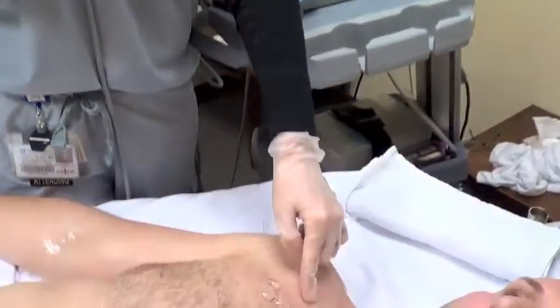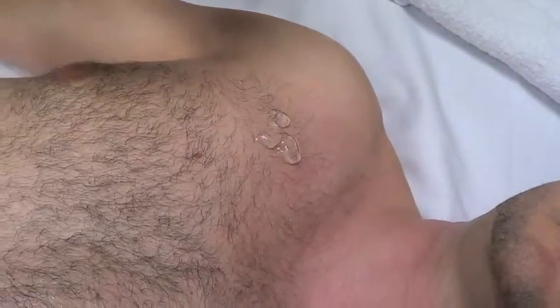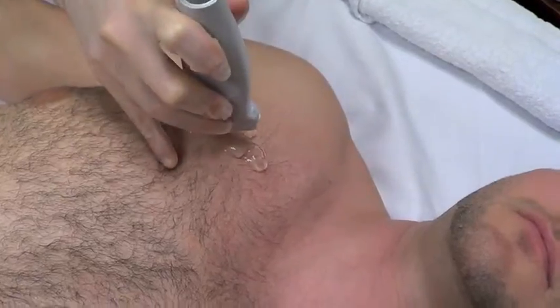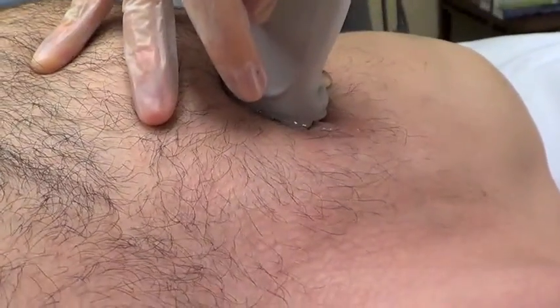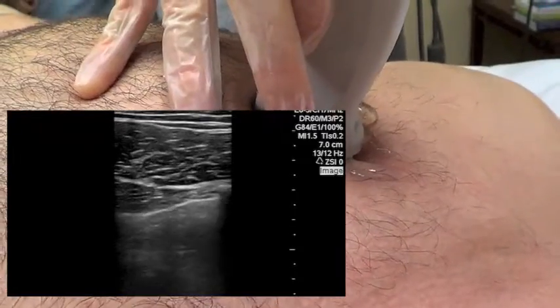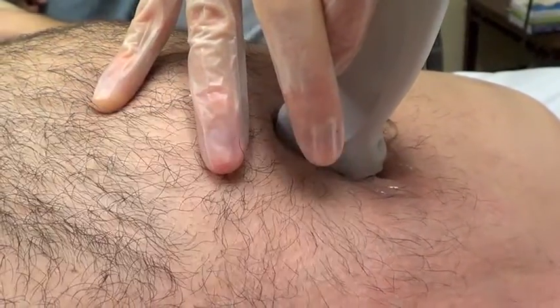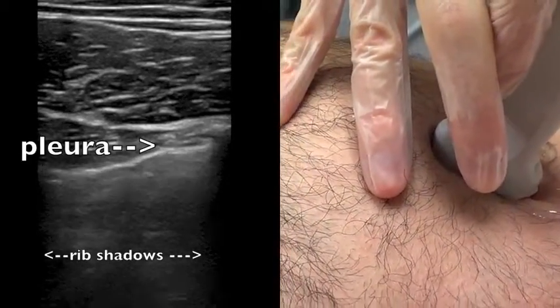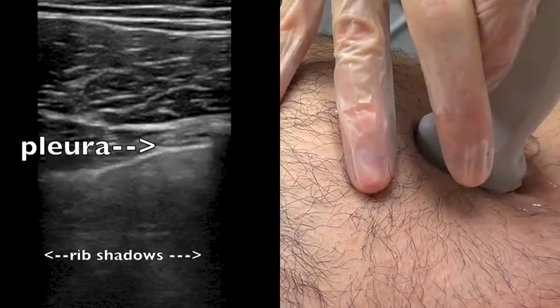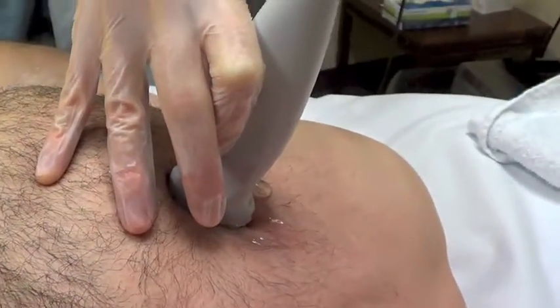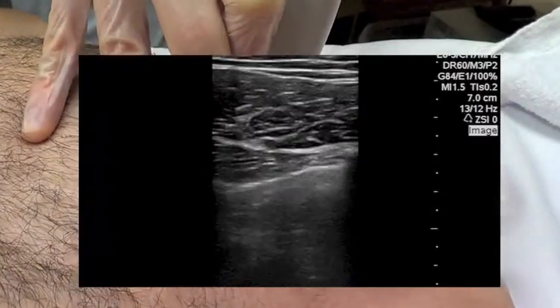Typically we go to about the second intercostal space. You want your indicator mark on the probe towards the patient's head, and you want to be in the second intercostal space. You can slide up and down until you find a rib, then slide it out of the center and center the pleural line — which is the first bright white line down from the rib shadow — between the ribs and hold it there to visualize the sliding.